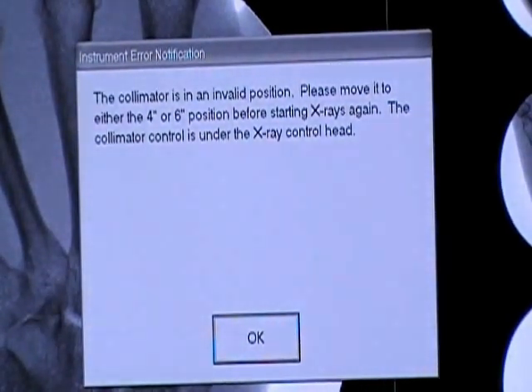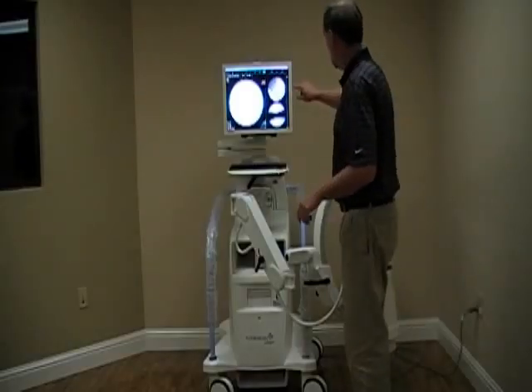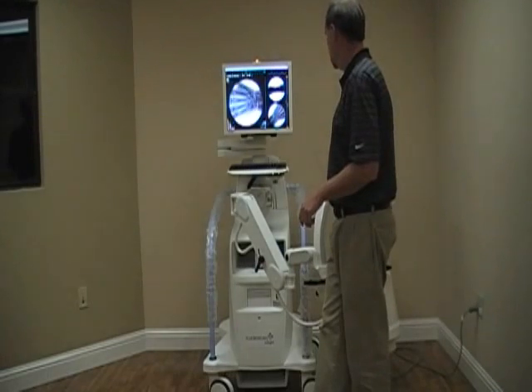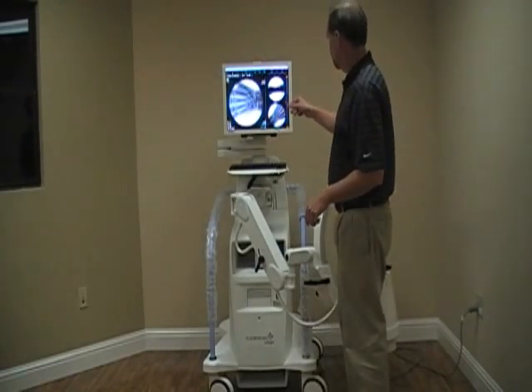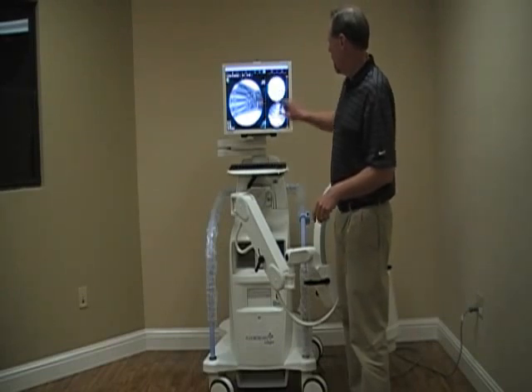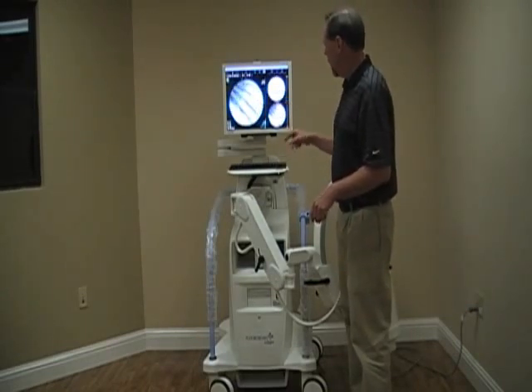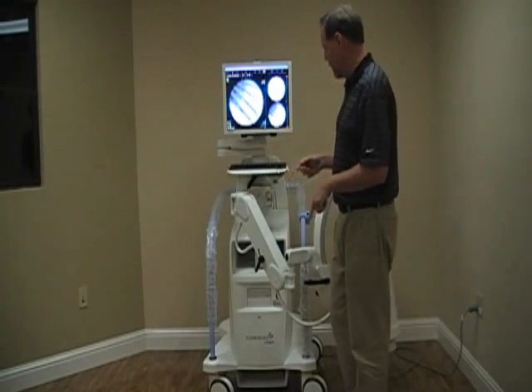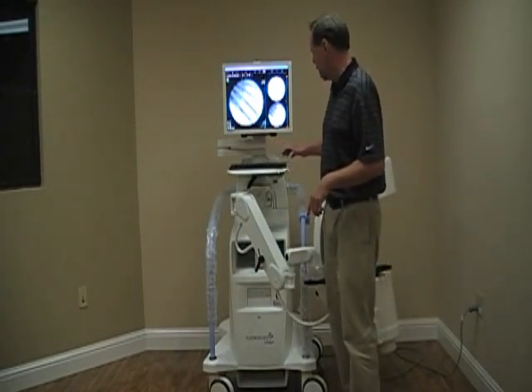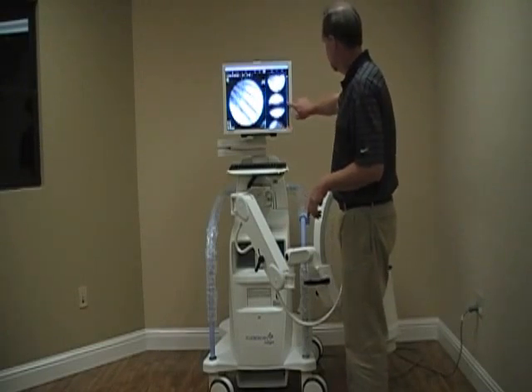It will say the collimator is in an invalid position — please move it to the left or the right for 6-inch. You'll use it in 6-inch 99% of the time. All of the images we take during the case are going to be on the right-hand side. Those will transfer over automatically. If the physician wants a different image on the left-hand screen, touch it and it'll bring it over. They can then print that from the foot switch or from the keyboard using the printer icon.